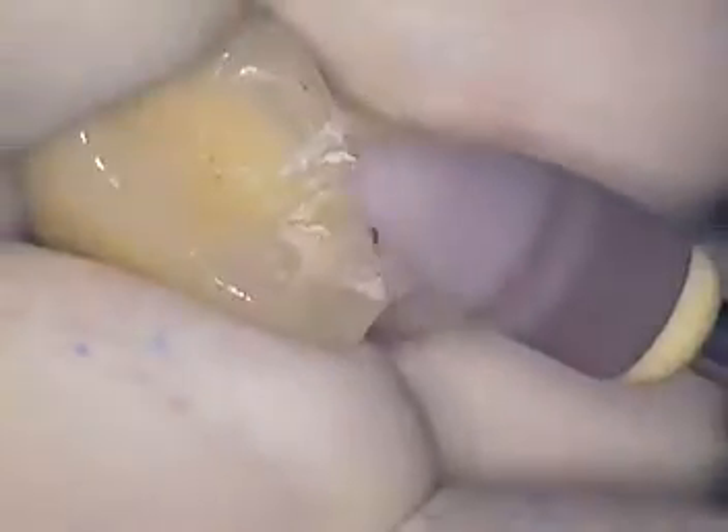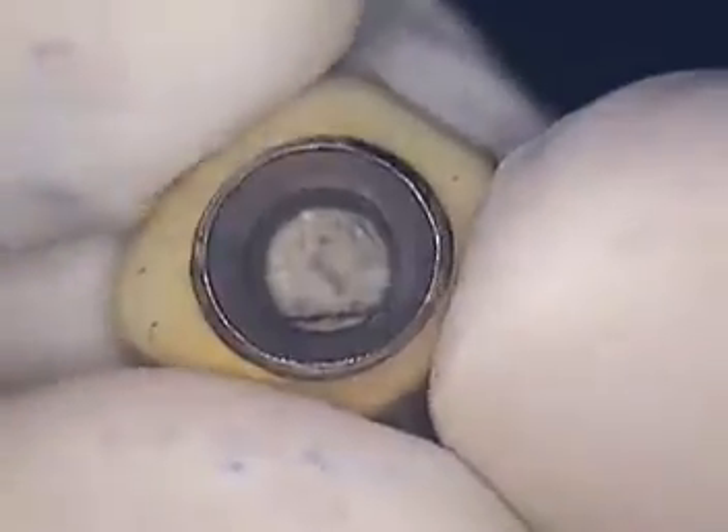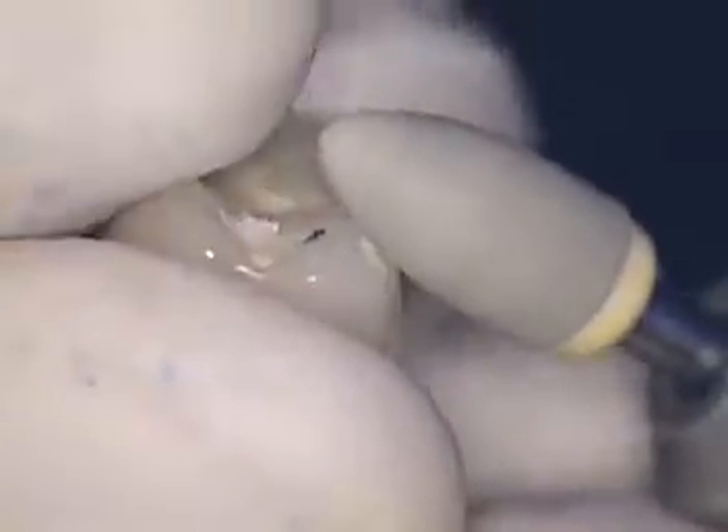A little polishing going on here. This is our implant crown — it's the second part; it could be a three or four part series. It's kind of a hot topic today being debated about what to do under the gum tissue. Are we paying enough attention to the undersurface of the solid abutment as it goes subgingivally? Various implant companies have different configurations, so you have to understand what you're dealing with.